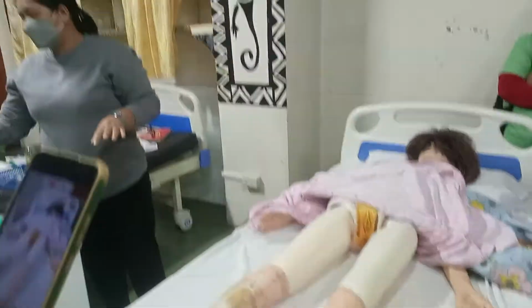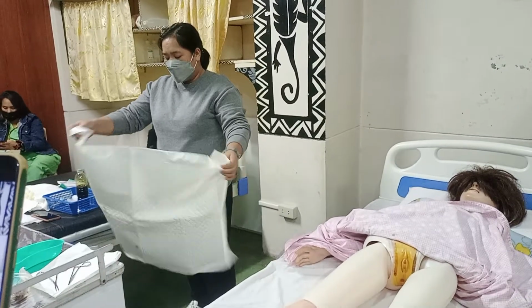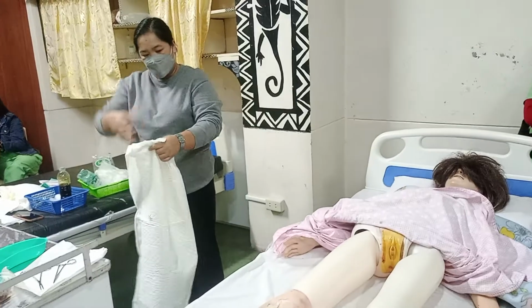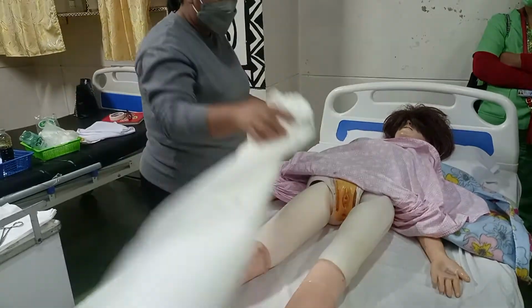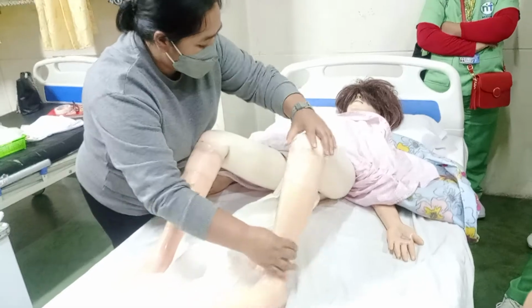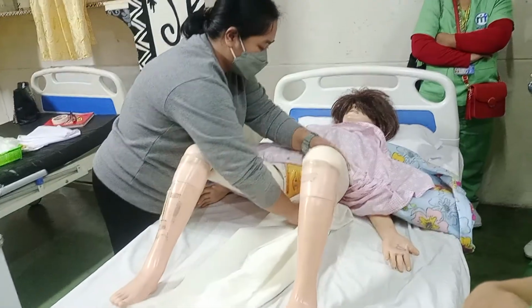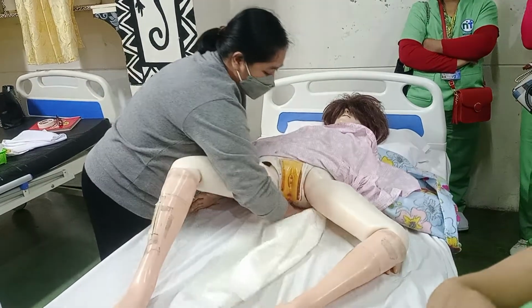I will first get my underpad. Pahaba po siyang ilalagay. Okay? Unlike sa bed making na horizontal. Okay, so ma'am, we are going to insert your catheter. So I will put your leg in the dorsal recumbent position. And at the count of 3, please help me to raise your sacral area or your buttocks. 1, 2, 3. Okay.